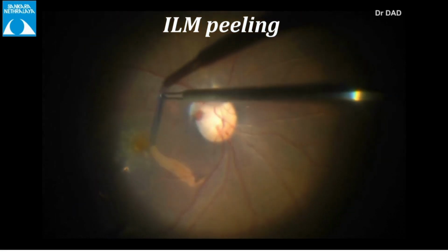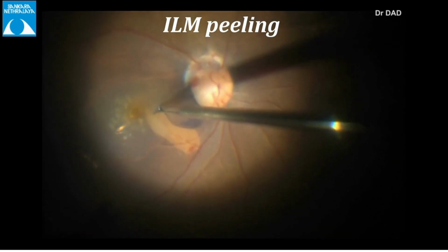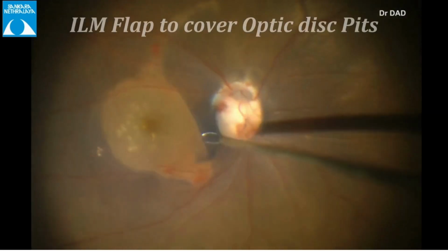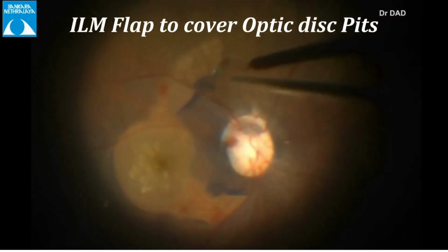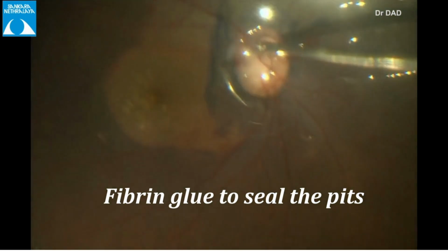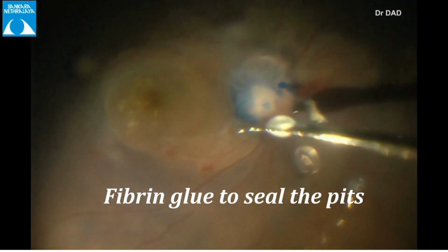After staining the ILM with brilliant blue, peeling was initiated with ILM forceps. Finesse loop was used to create ILM flaps which could be inverted over to cover the optic disc pits. A drop of fibrin glue was placed on the pit areas and the ILM flap covered on it to cause a sealing effect.